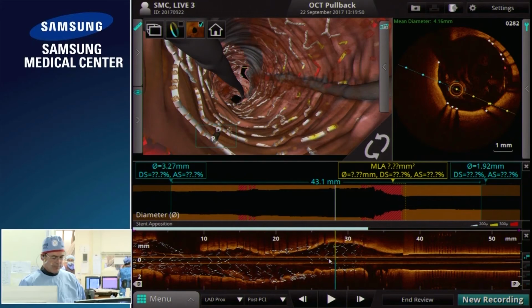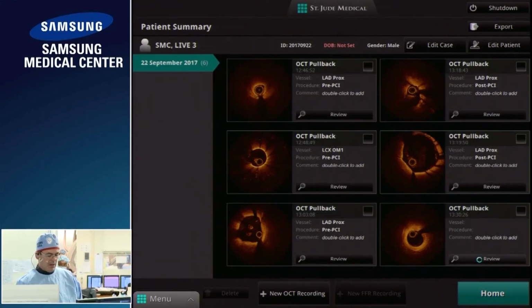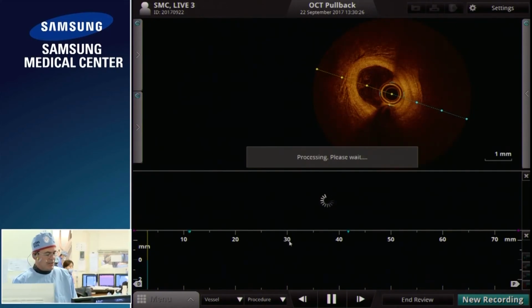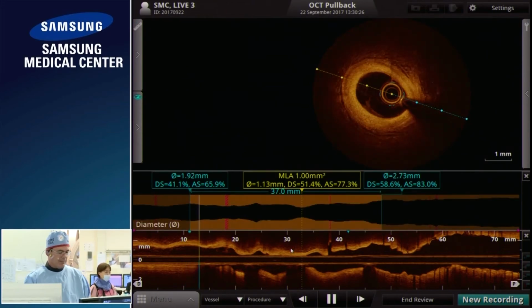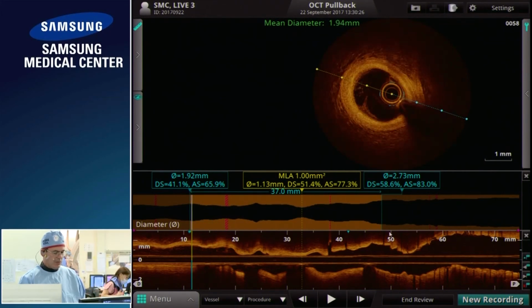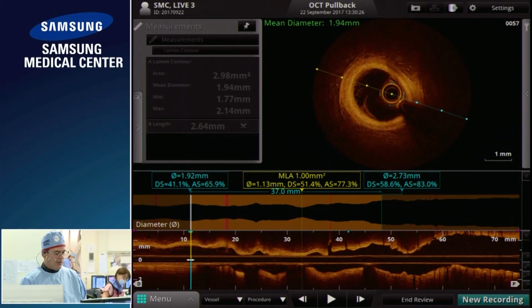Okay. Can you show the distal end? Okay, we've done some more recordings. We are doing fine with the proximal left main, but we haven't shown the distal. This is the distal vessel. Now we put in another stent at the end, and we're now left with the distal vessel looking like this. If I just take you through these pictures, this is that distal vessel. It doesn't look too diseased, but this is after the third stent.